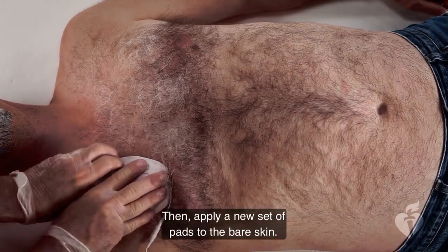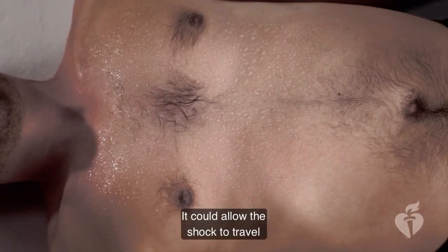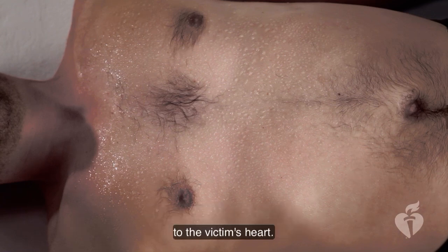Then apply a new set of pads to the bare skin. Excessive water on the victim's chest can also be a problem. It could allow the shock to travel through the water between the pads, ultimately preventing delivery of an effective shock dose to the victim's heart.